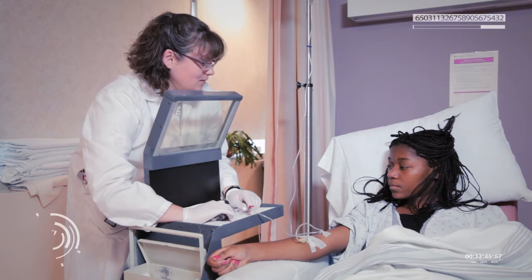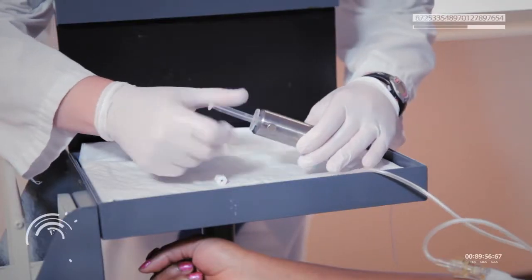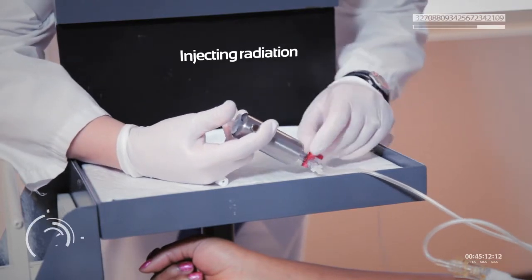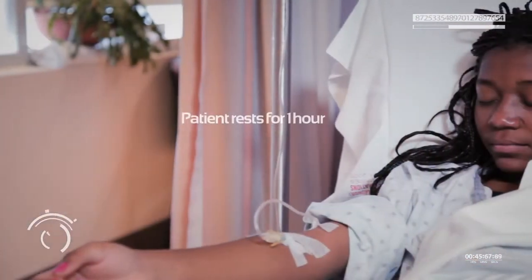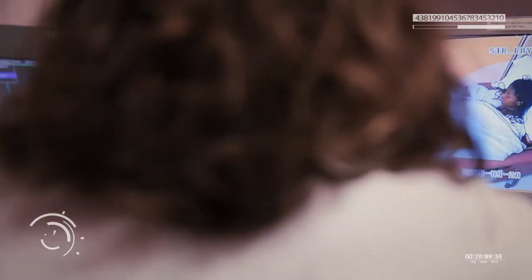Once the injection is done, people just lay around for an hour while the glucose moves through the body. They don't want their muscles to start using the glucose. The technologist told me she would watch on a camera and get me after an hour.